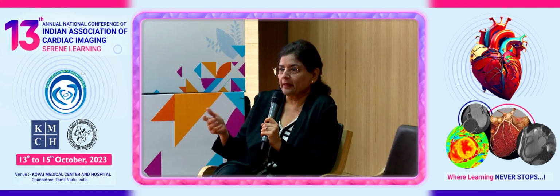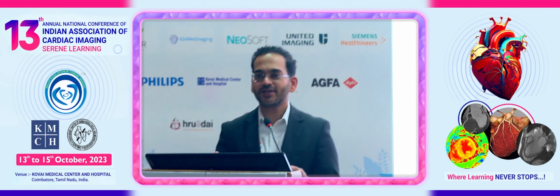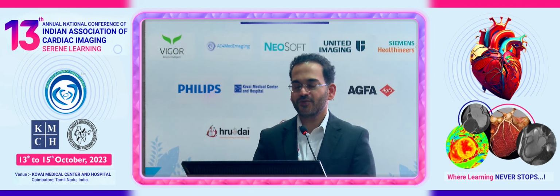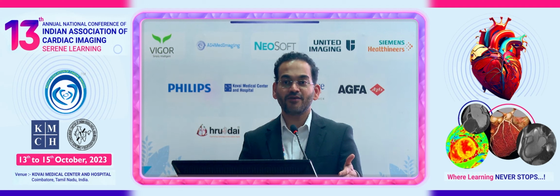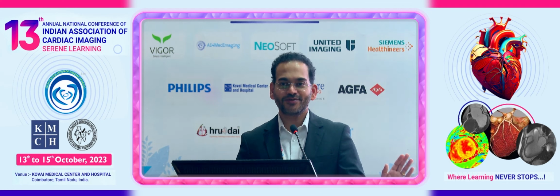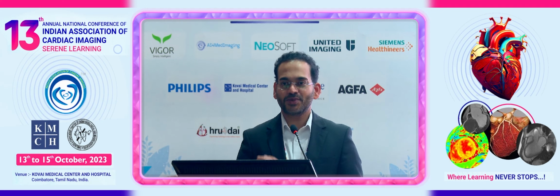One more comment I wanted to make, and this is something we are incredibly proud of. We have a 3D lab at Mass General Hospital. When we hired the 3D lab techs, the first 1,000 cases that they did were checked by me and a colleague of mine. They have gotten so good that our interventional cardiologist said, forget the industry report, what did our guys say? Every single case that has a discrepancy has proved us right.